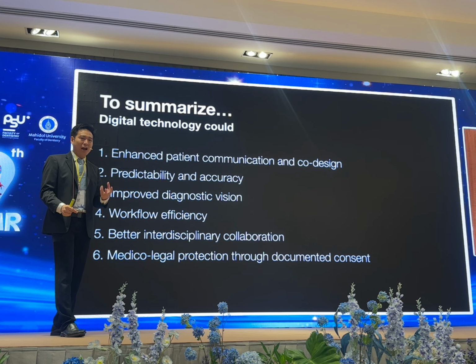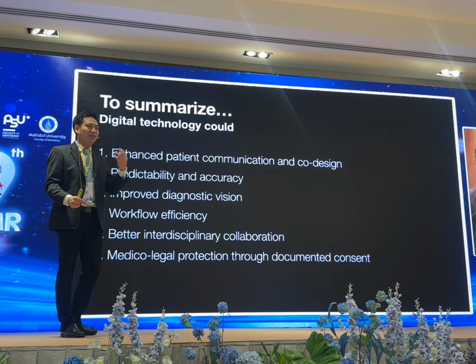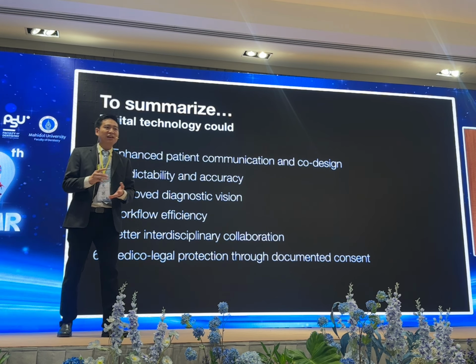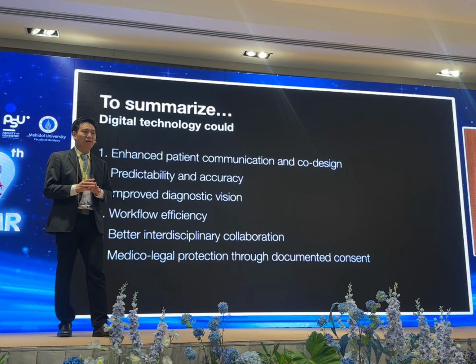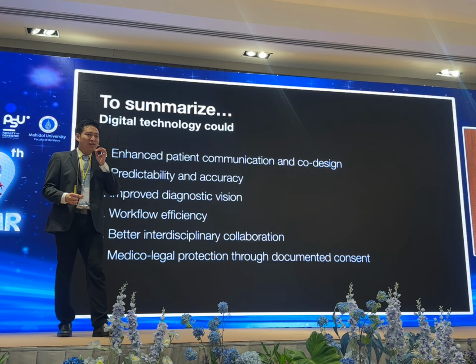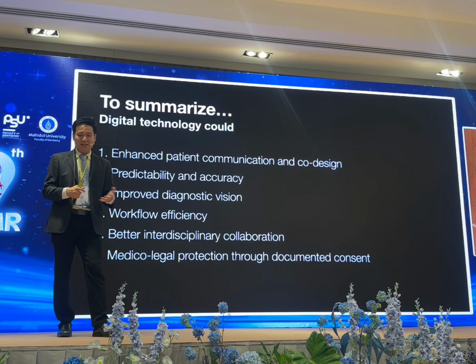Does the design of the teeth reflect your expectation, reflect your personality, or do you want it a little bit more aggressive? Sometimes patients have different personal preferences. Some want it a little bit longer, some a little bit softer. It depends on the patient.